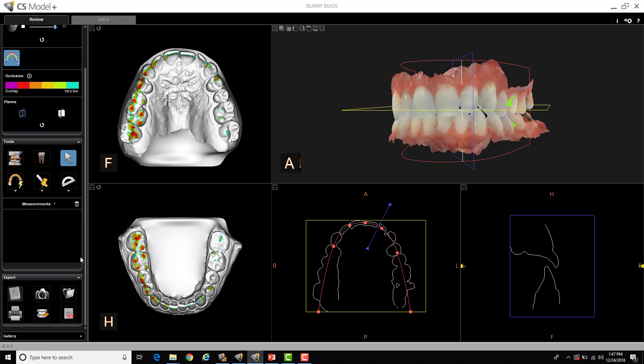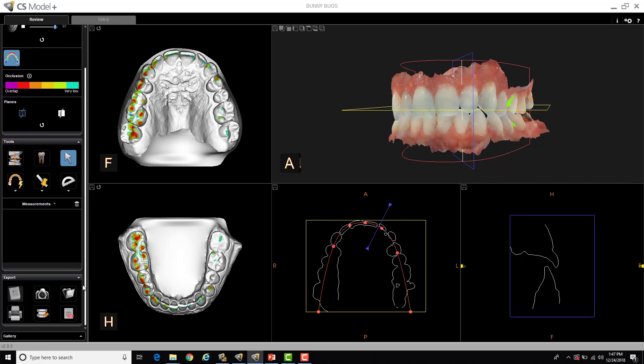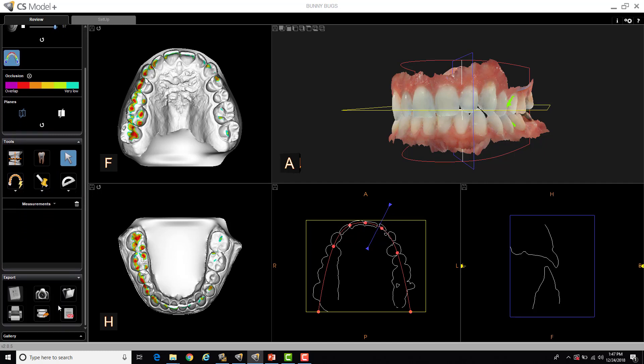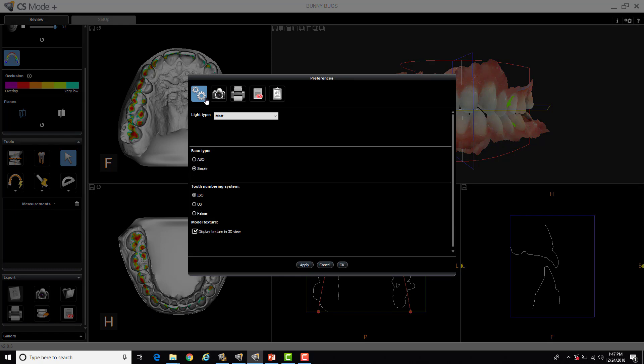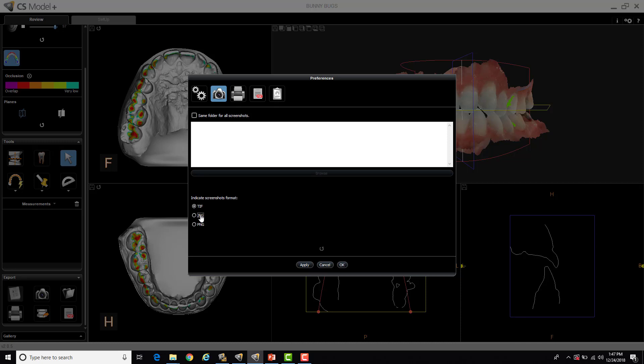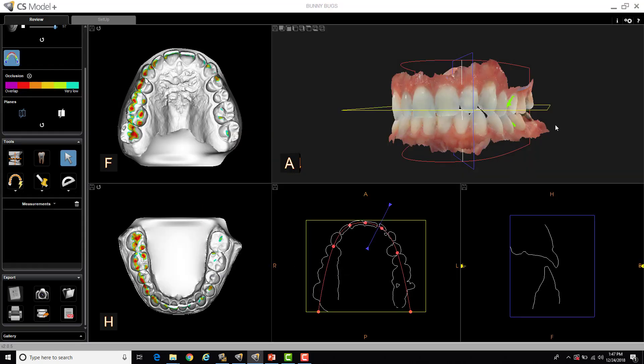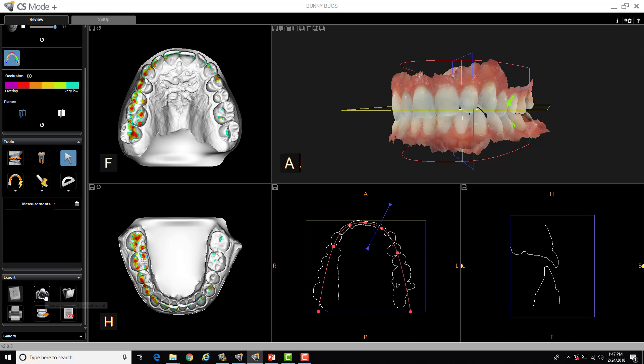So down below, you can see here, I can scroll my scroll bar down below and capture a screenshot of the entire page. So I just select this camera icon and it will capture a picture of the entire page. In the preferences, if you select your gears up top under your camera icon, you can change this from a JPEG or from a TIFF to a JPEG. Both are pretty similar. Sometimes I've seen in different applications, when you use those images, JPEGs are a little bit more user-friendly. But you can play around with that in whichever one you prefer. So I actually captured one as a TIFF and I'll capture another one as a JPEG.